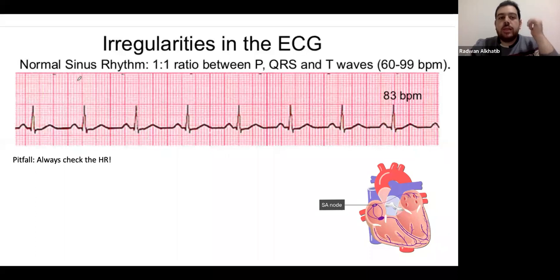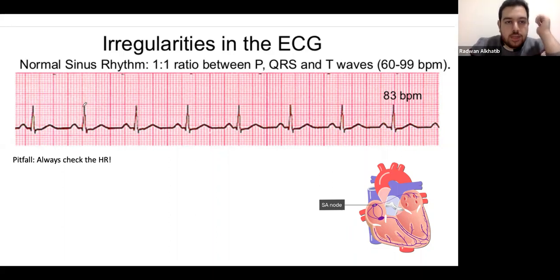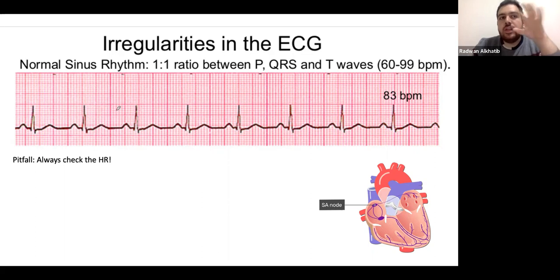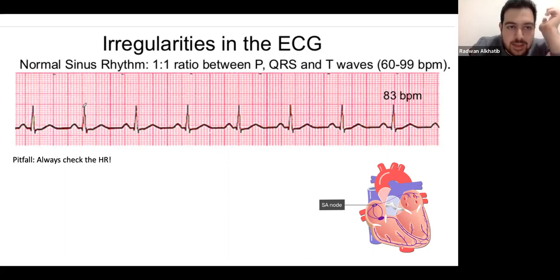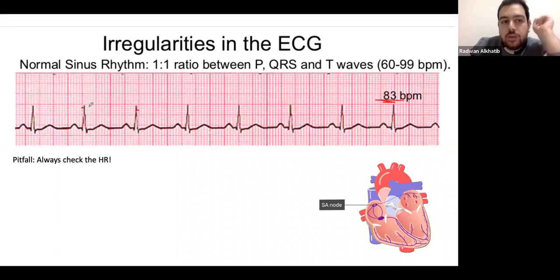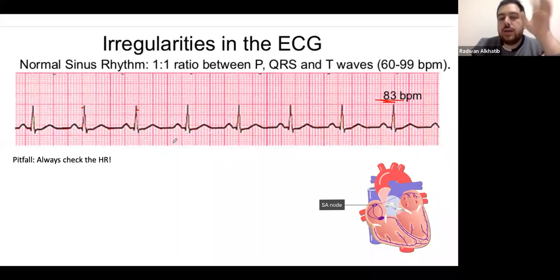For a normal sinus rhythm example: calculating big boxes between RR gives about four boxes, suggesting approximately 75 bpm — but using small boxes (18 × 0.04 = 0.72 seconds per beat, then 60 ÷ 0.72 = 83 bpm) gives the more accurate answer of 83 bpm. This illustrates why the big box method is an estimation and the small box method gives exactly the right answer.